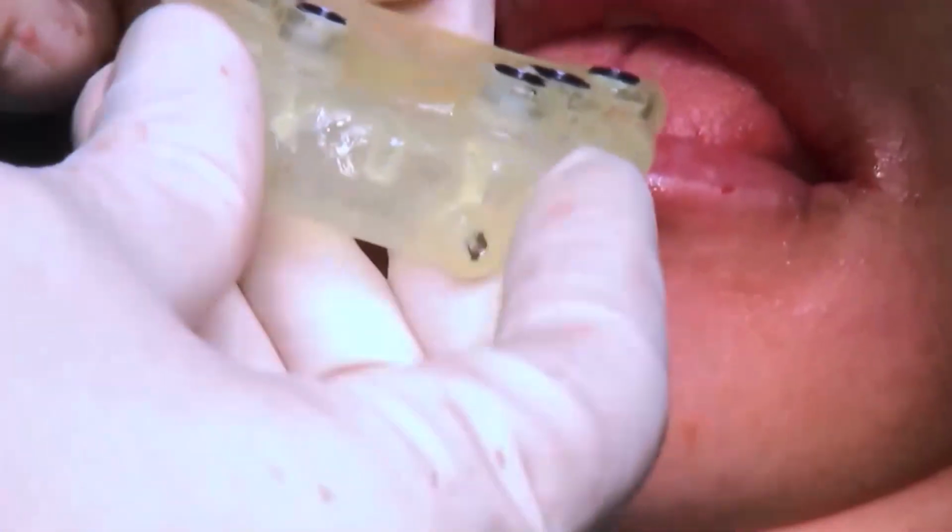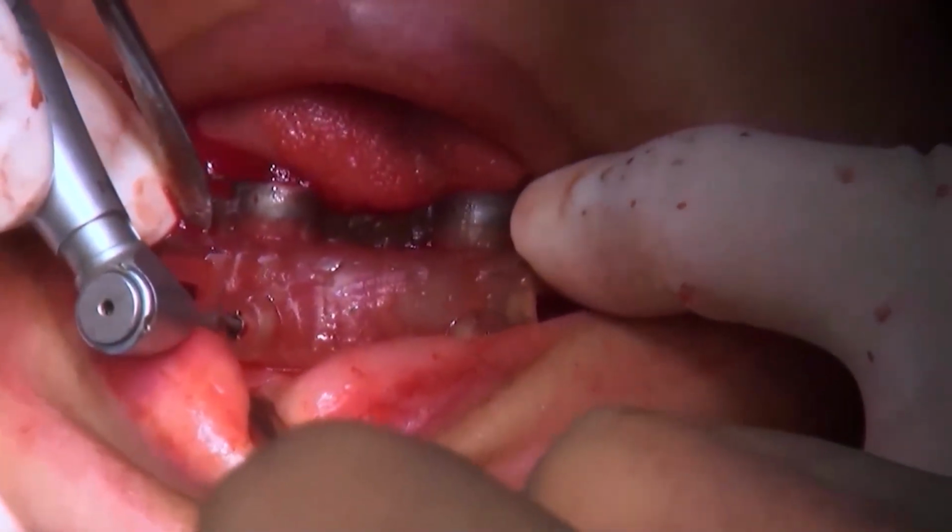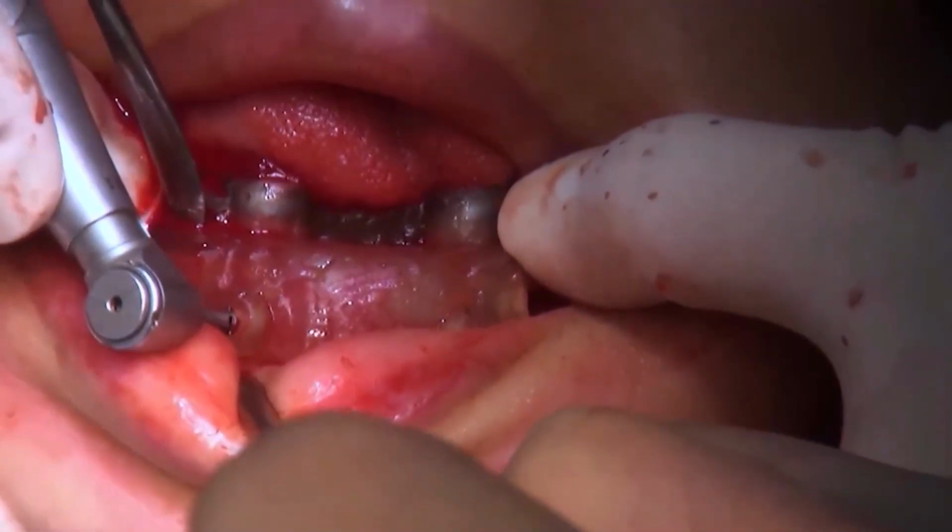The surgical guide part is now connected to the foundation part of the bone reduction guide.